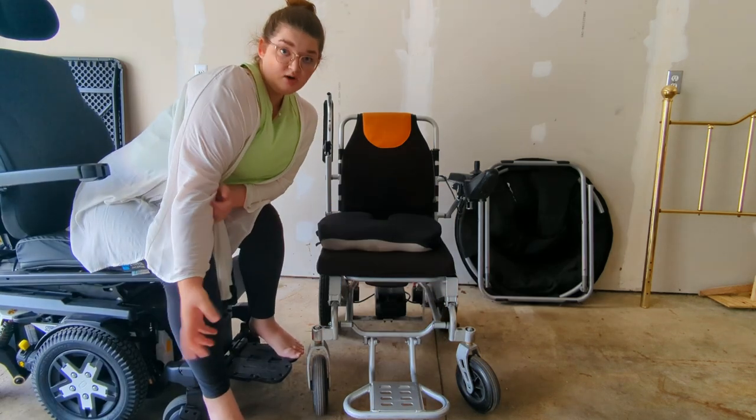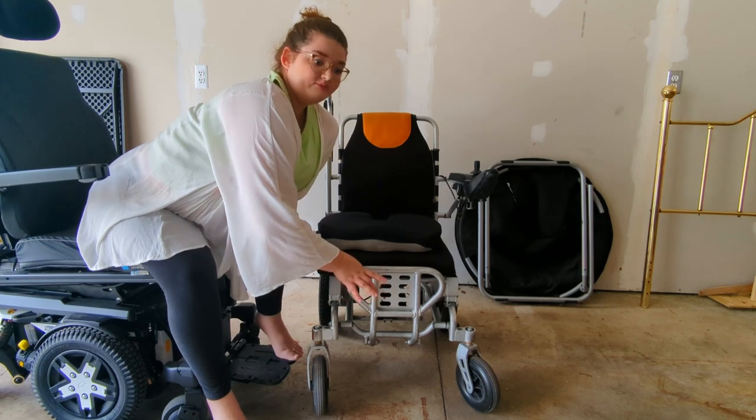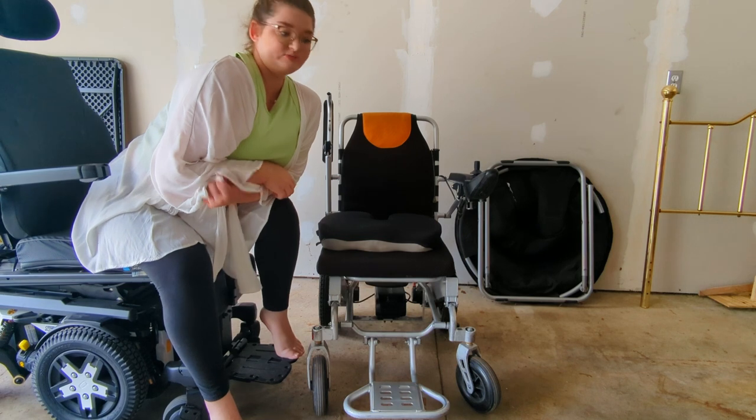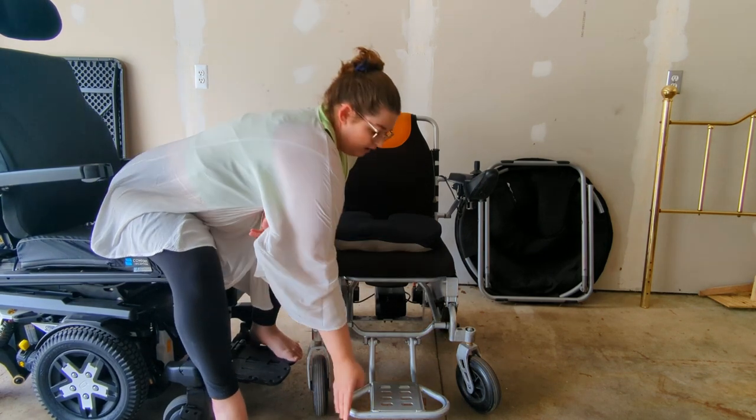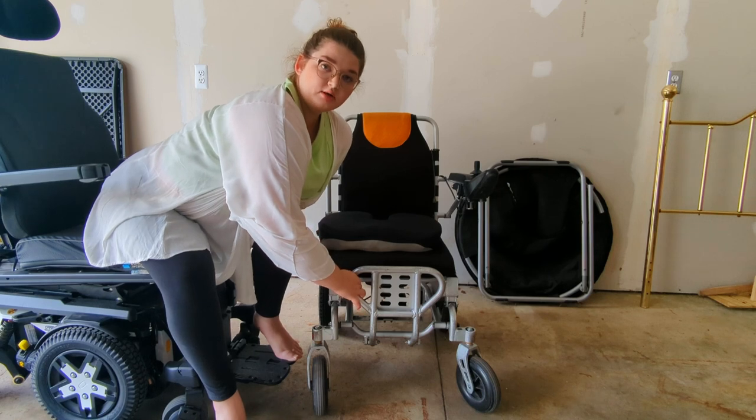Another thing to point out — the foot plate comes up, so if I need to do a transfer off the front, it doesn't stay up very well on its own. But if I'm needing to do a transfer out of the front of the chair, I'll flip this up and then put my feet directly on the ground, and that works really well.